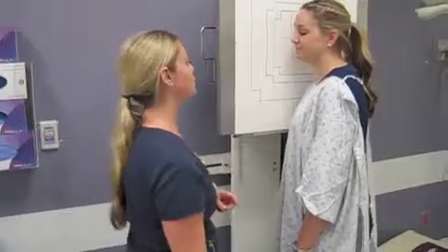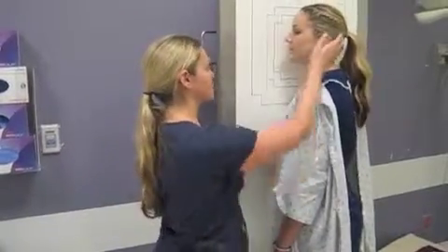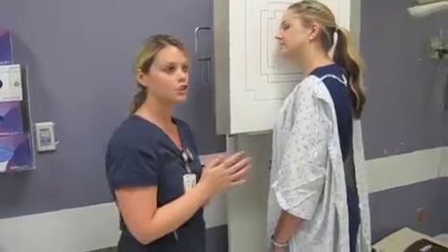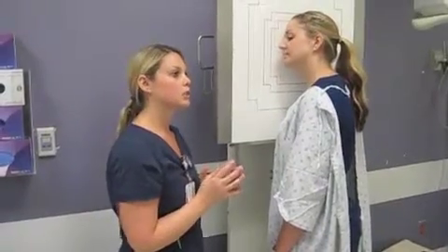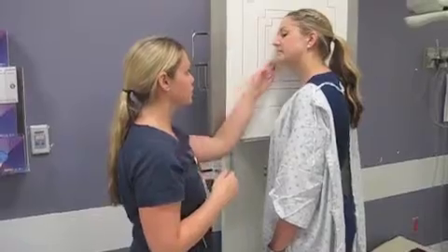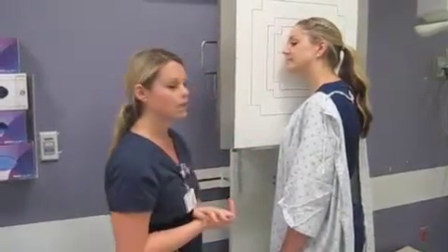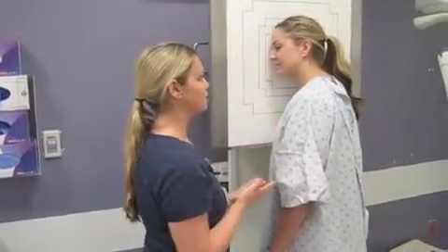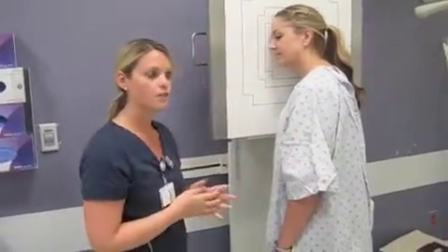Okay, so now we're going to do her obliques. First we do an RAO, and her head is going to tilt 30 degrees inward. And then the tube is also going to be 25 degrees cephalic. And the central ray is going to exit the mandibular portion closest to the IR, because that's the side we are looking at. We also do the other oblique, so she turns around and does the same exact thing.